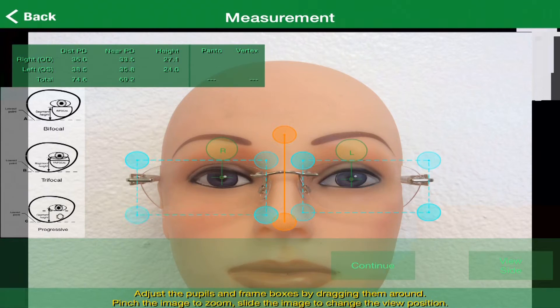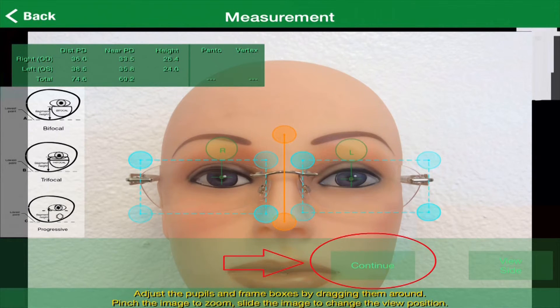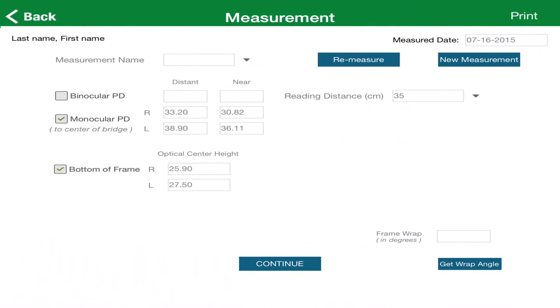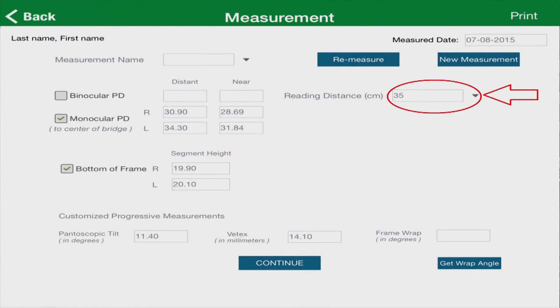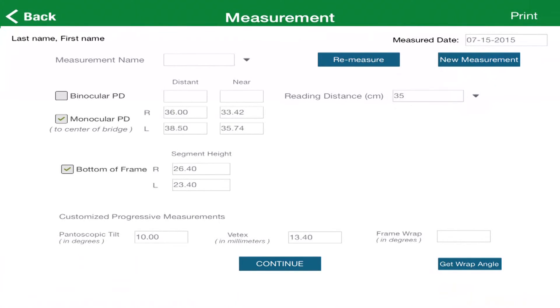Once you are done with the front frame measurements, press the Continue box on the bottom of the screen. You will be taken to a new screen where all of your patient's data is shown, captured, and summarized. You'll notice that you can change your patient's reading distance by either entering the distance yourself or using the drop-down box and touching one of the preloaded distances. The reading distance has been preset for 35 centimeters, which is standard.